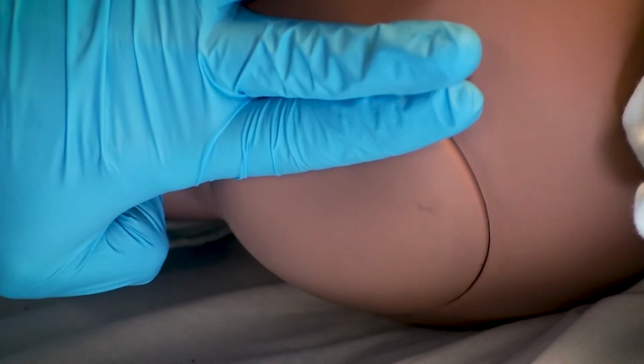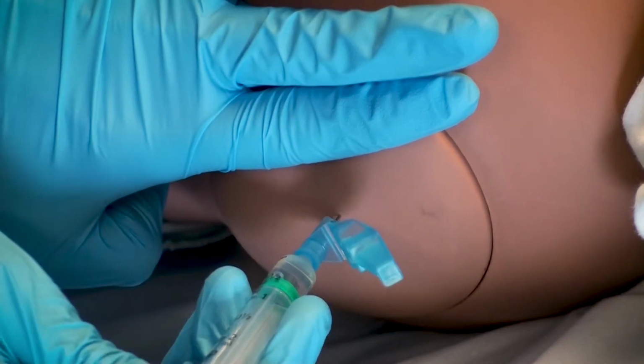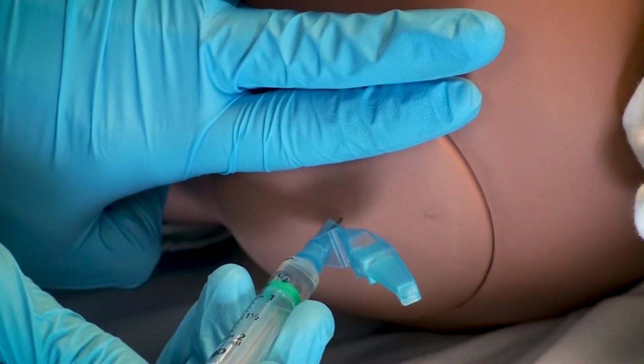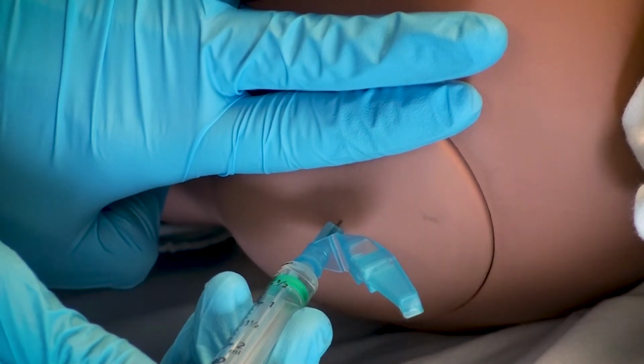Verbally prepare your patient prior to inserting the needle and insert the needle at about 90 degrees, leaving about 1/3 of the needle out of the skin. Prior to injecting the drug, you must withdraw slightly to ensure that you have not hit a vessel, and then inject the drug to the patient.